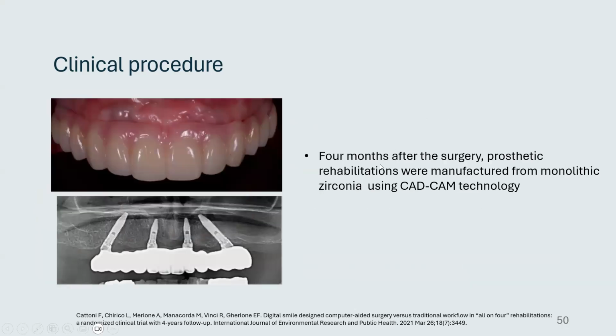Okay, after 4 months, the patients were ready for the prosthetic rehabilitation for the definitive restoration, which were made with monolithic zirconia using the CAD/CAM technology. And here the panoramic X-ray of the implants in the prosthesis.